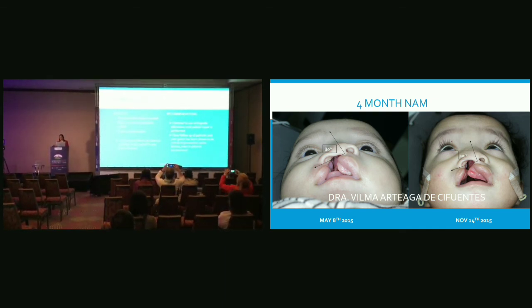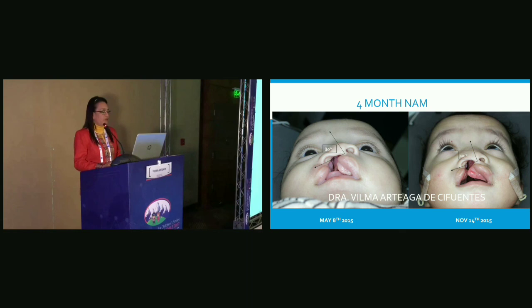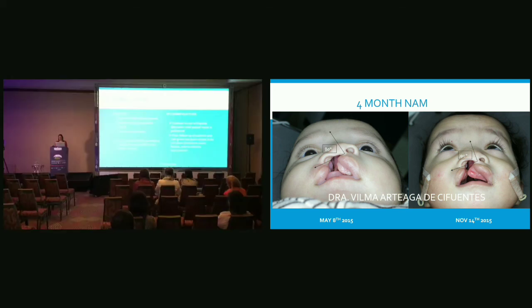So for conclusions, the benefits of this technique are normal mid-face bone growth, a more natural and aesthetic profile on both sides, and easier surgical repair with less scar due to less tissue tension and less need of extended dissection during surgery. And the most important thing is that no adverse effects are done to the maxillary bone growth in any plane of space.